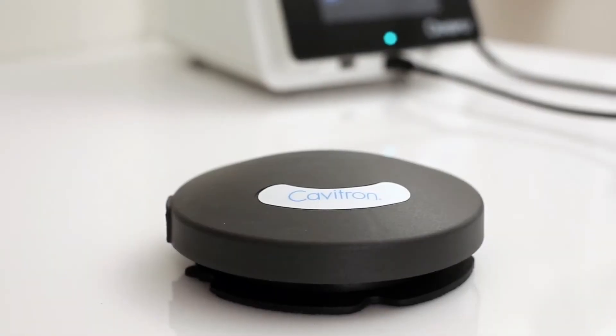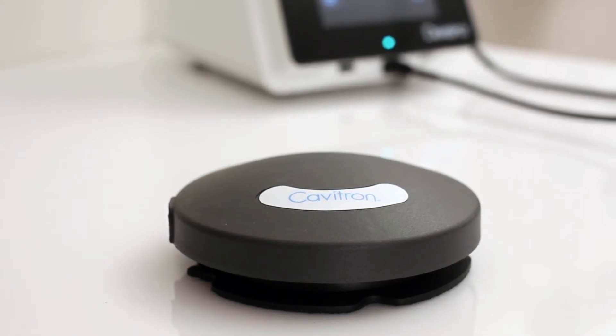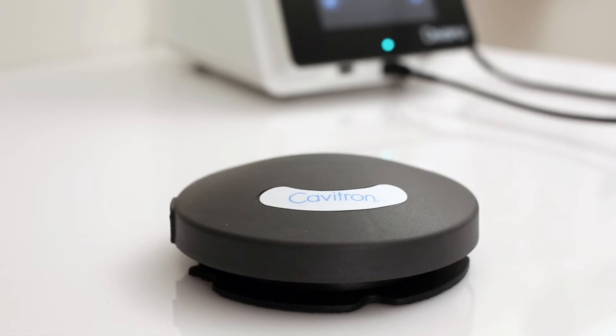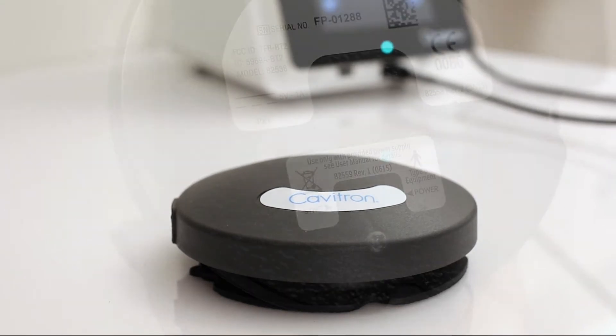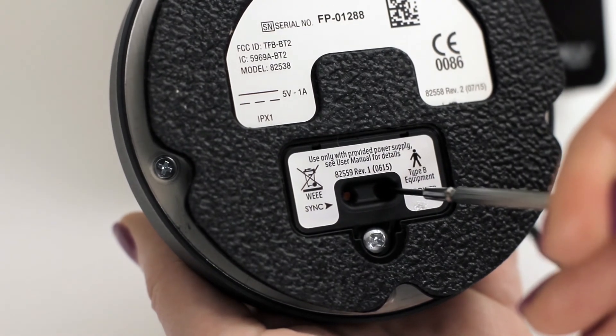The foot pedal is packaged with the power off. The foot pedal must be turned on prior to use. The foot pedal will not charge in the off state. To turn on the foot pedal, press and hold the power button for 4 seconds.